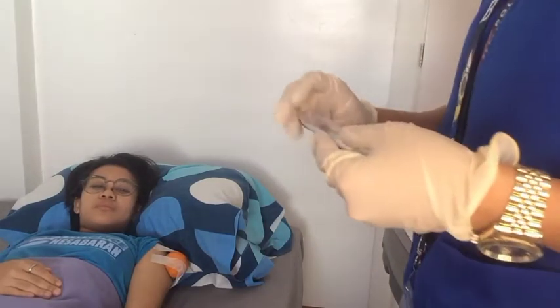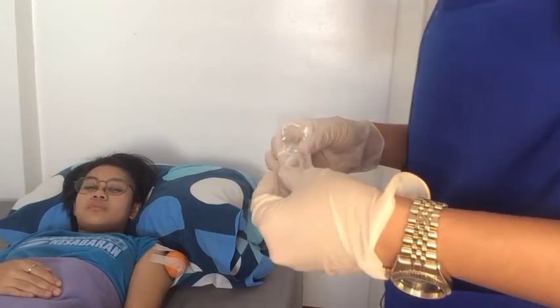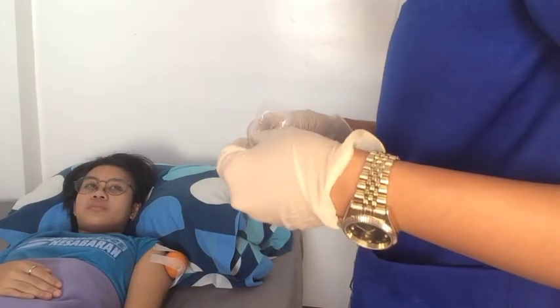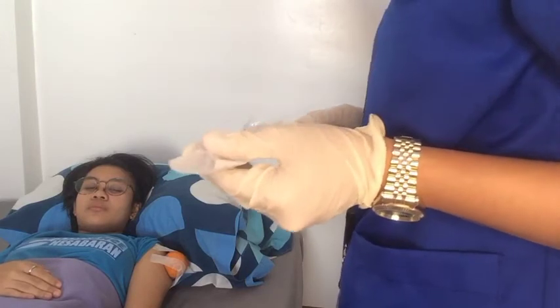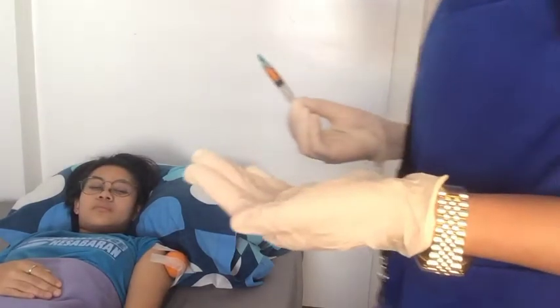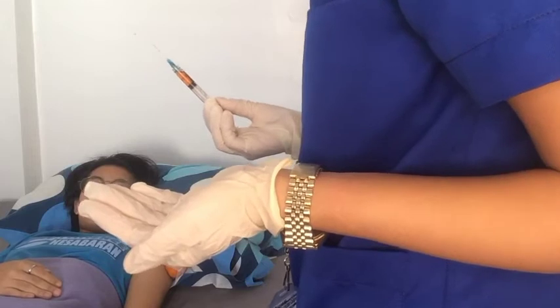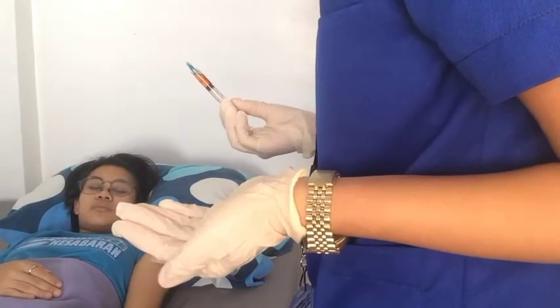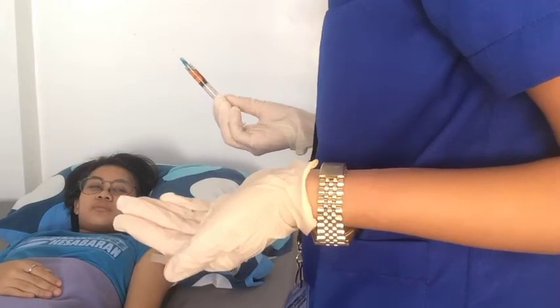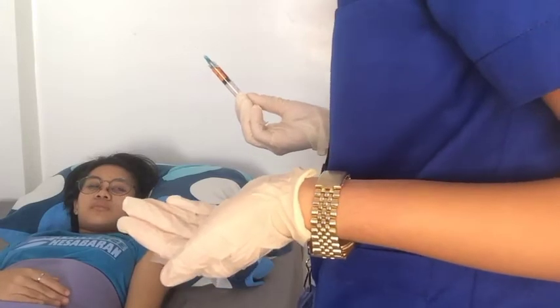So I have here the syringe with the medication, which is the epinephrine. Now prepare the syringe for injection. Remove the needle cover and discard without contaminating the needle. If using prefilled unit dose medication, take caution to avoid dripping medication on the needle prior to injection. If this does occur, wipe the medication off the needle with sterile gauze.